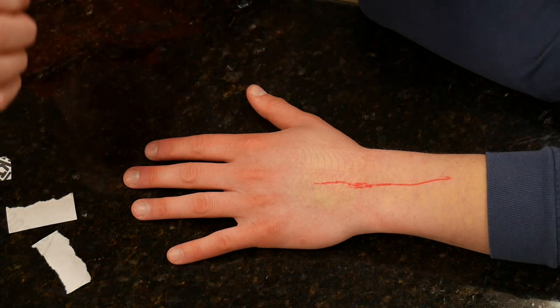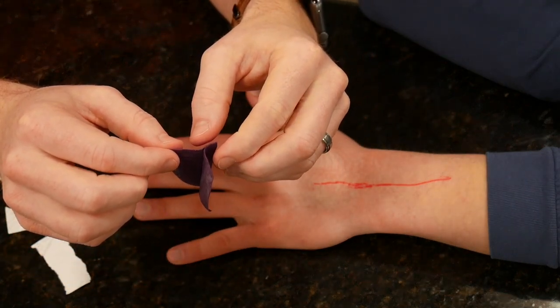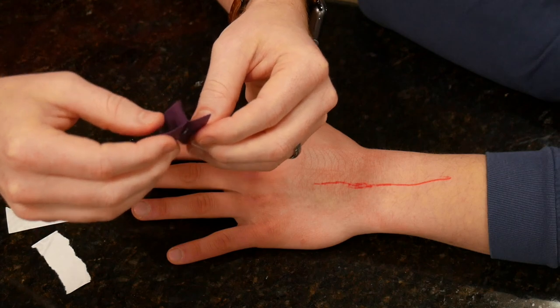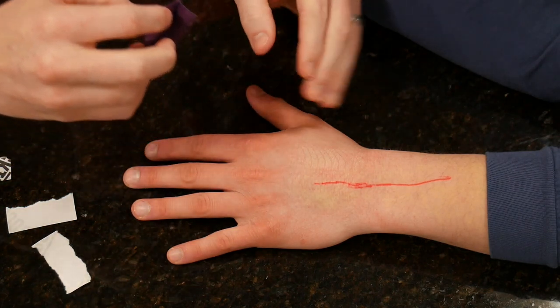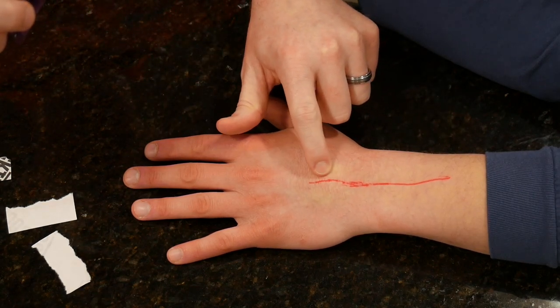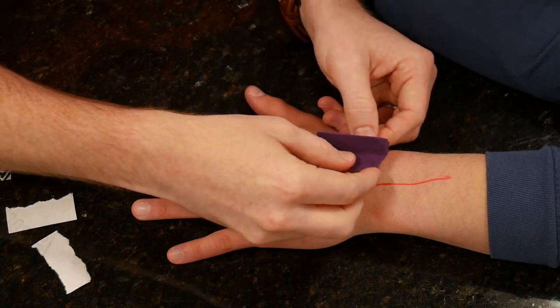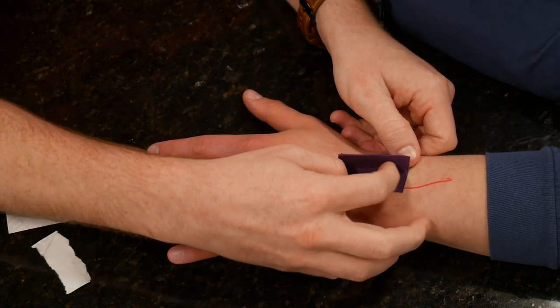Okay, so you end with something like this right here. Now if you want that a little taller, all you got to do is just stick it a little bit more. Main thing is you just want to leave a little bit of tape that's going to actually stick to your patient. So let's say for Dylan here, we're really having a hard time with his EDC and the scarring right in here, especially around the extensor retinaculum. So we're going to place that right around that, right on either side of it.